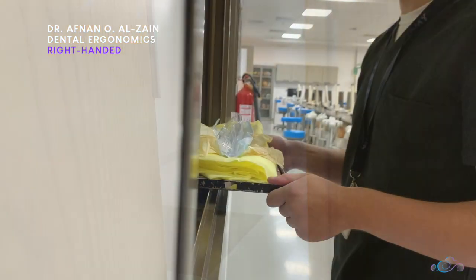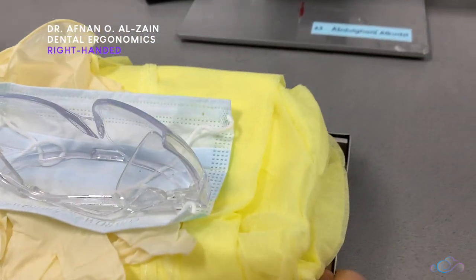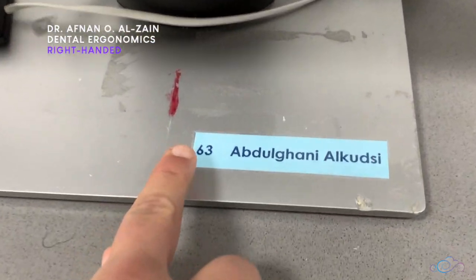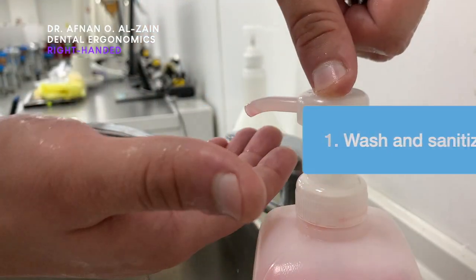Once you enter the sim lab or the phantom lab, you're going to receive your instruments and then head to your unit. Make sure that you are sitting in the unit with your name on it. Then you're going to wash your hands and you can sanitize your hands.